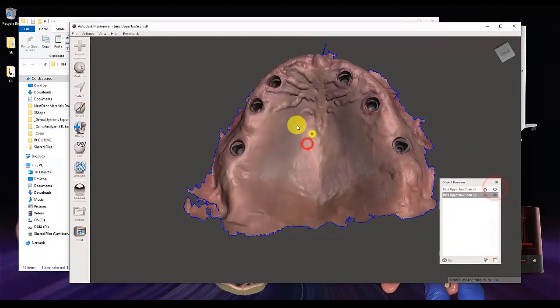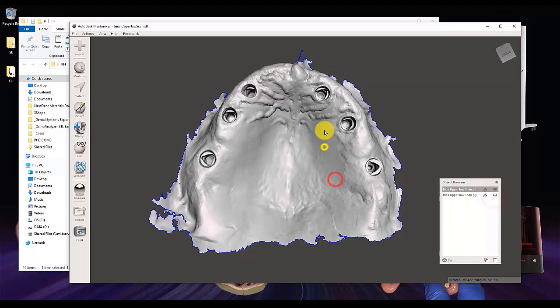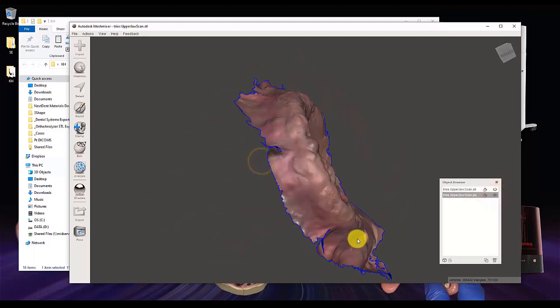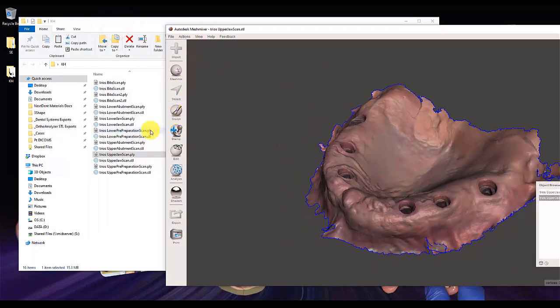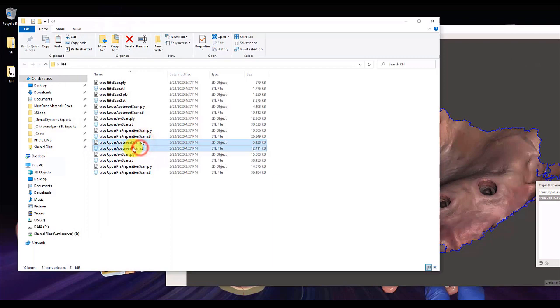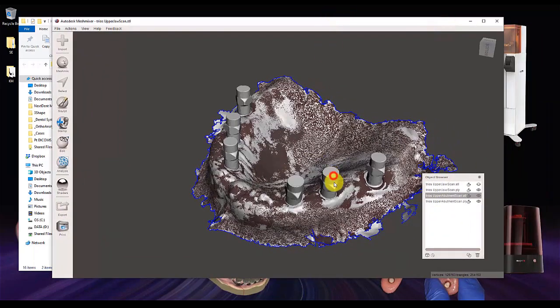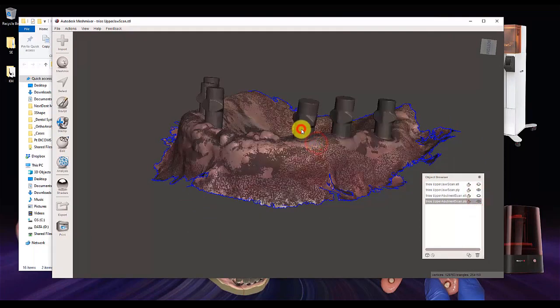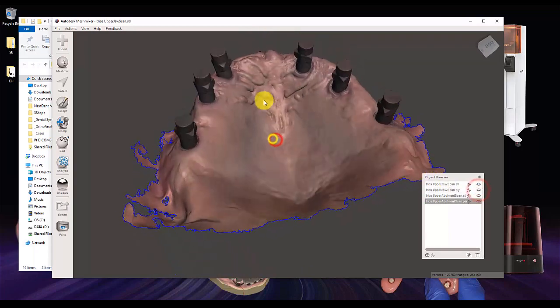So here it is in color. That's the PLY, and here it is in black and white, which is the STL. So looking here at our files, everything here looks pretty good. Let me also go ahead and drag in our abutments. So I'll drag in both our STL and PLY file formats of our scan bodies. And here are our scan bodies. This right here is our STL file format, so I can go ahead and turn that off. And now you'll be able to see really nice color definition here of our scan bodies in place.